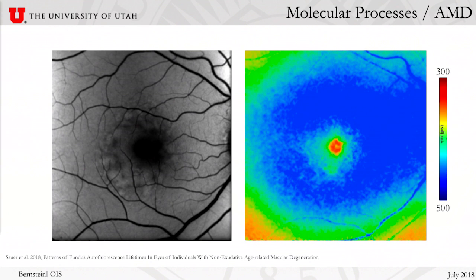In age-related macular degeneration, we see much more than conventional imaging. We see long fluorescence lifetimes in the long channel in almost every single AMD eye. And this is in areas that are clinically normal. In fact, when we look at age-matched normals, one third of them also show this unusual and unique finding, and we think that they may be at risk for future development of AMD.